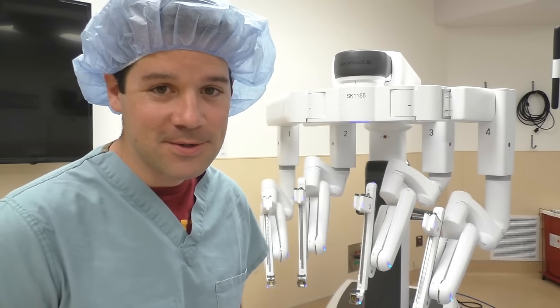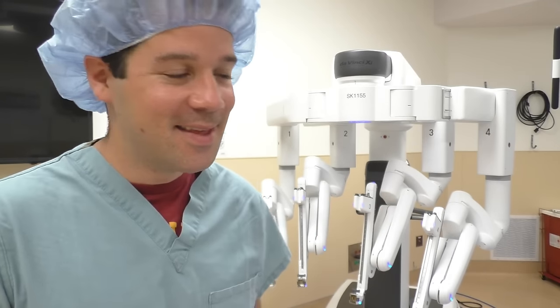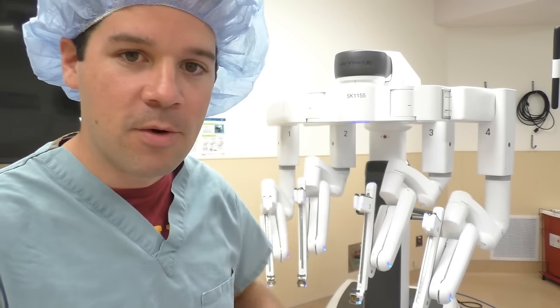Hey guys, welcome back to another Surgical Tech Tips. Today we're going to be talking about the robot. This is a DaVinci XI robot. This is their newest iteration of their robotic systems.